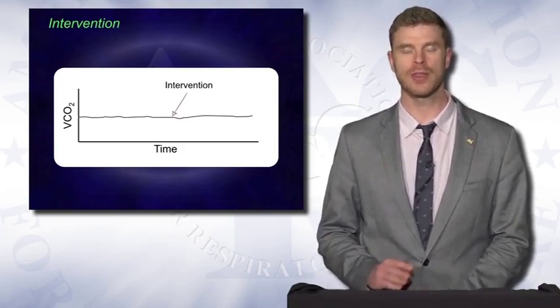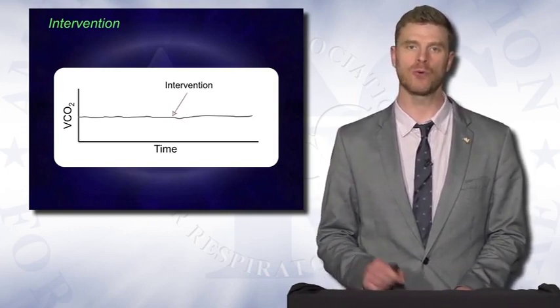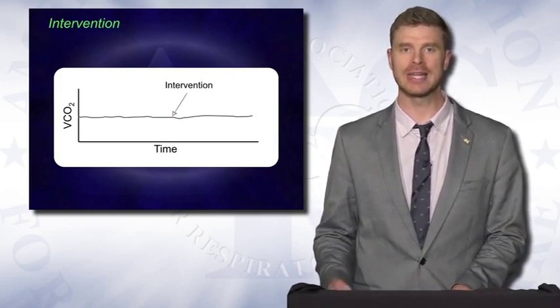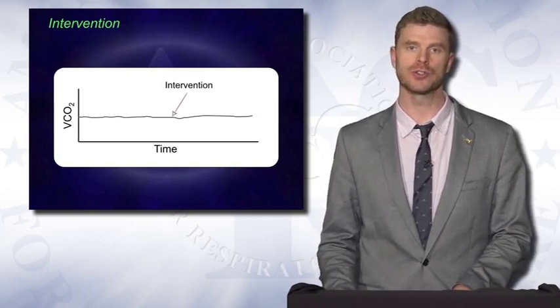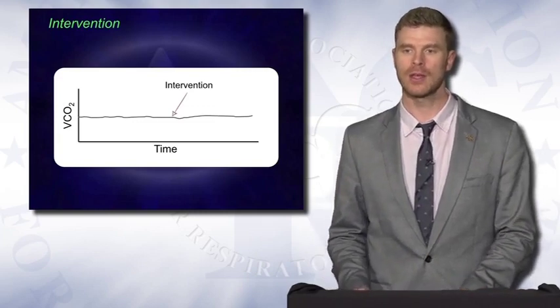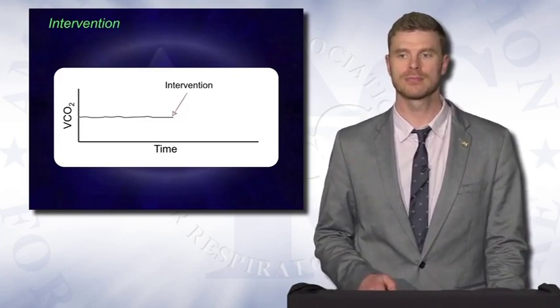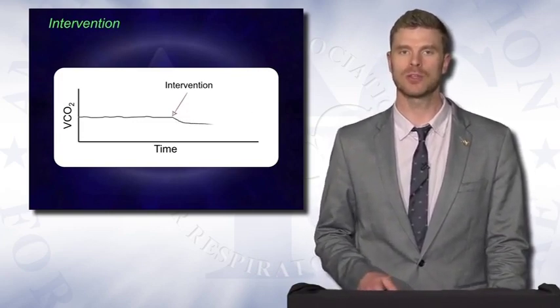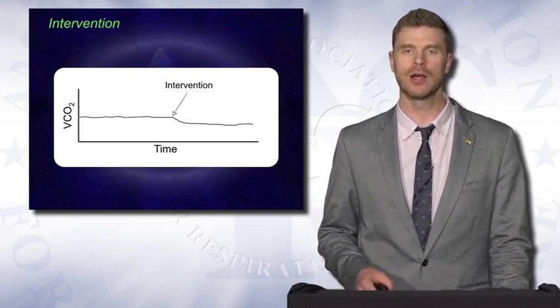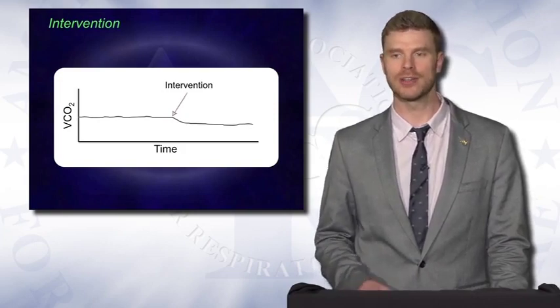An important thing to do with any of these procedures is to ensure that everything stays as similar as possible before and after the intervention to preclude confounding changes from inaccurately increasing or decreasing your VCO2. That'll enable you to get the clearest snapshot of what's happening to your patient. In some patients, we may see an increase in VCO2, perhaps a decrease. Again, not a whole lot of data support this in the literature, but if you can buy into the physiology, which is fairly sound, then it could perhaps be recommended in some instances, but please study it.